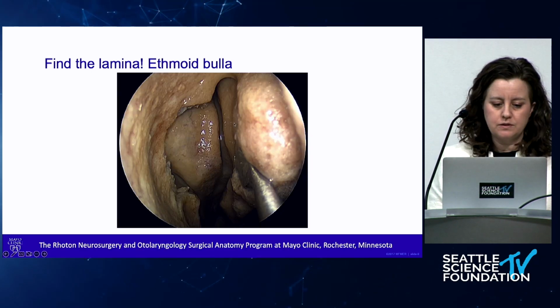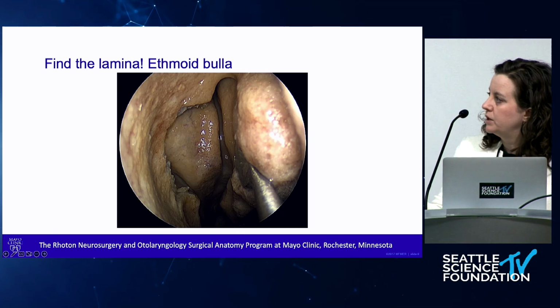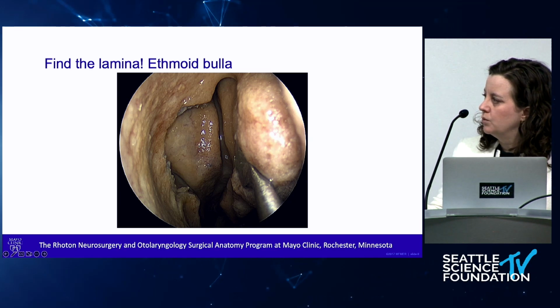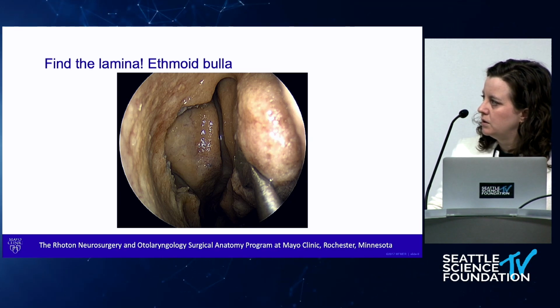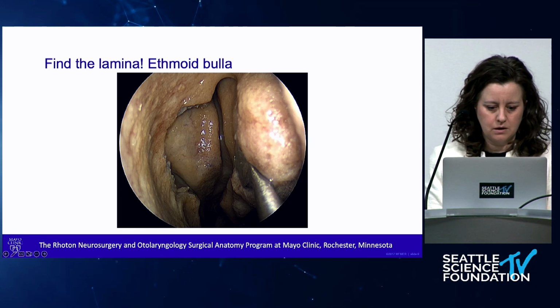So again, here's just a still shot. That uncinate is gone. There's the bulla. That's the retrobullar recess. And we're starting to see the basal lamella. So to do an anterior ethmoidectomy, you want to start with that view with the uncinate gone.